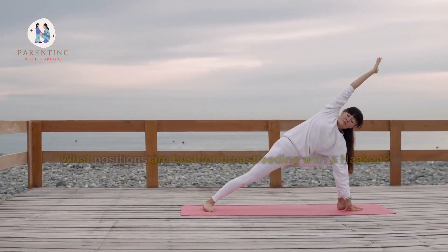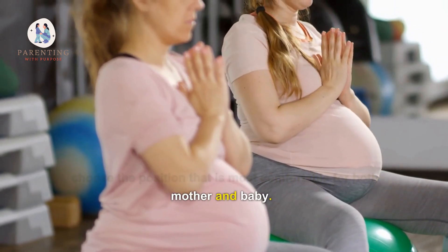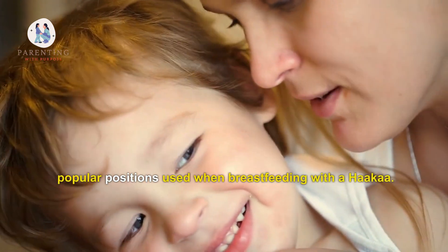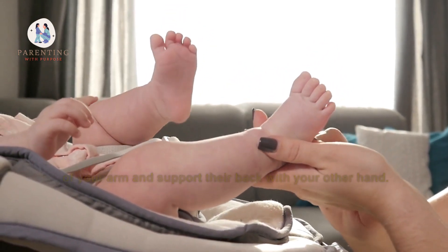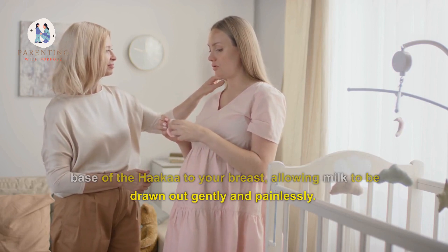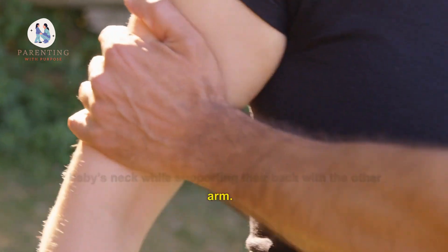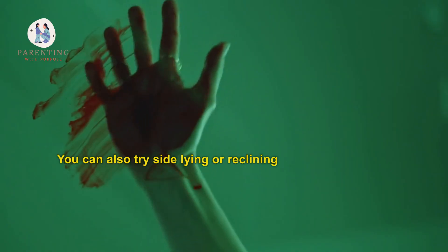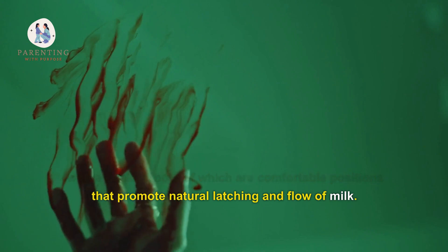When breastfeeding with a Hakaa, it is important to choose the position that is most comfortable for both mother and baby. The cradle hold or cross-cradle hold are two of the most popular positions. In the cradle hold, you place your baby's head in the crook of your arm and support their back with your other hand. You can then use your free hand to attach the suction base of the Hakaa to your breast, allowing milk to be drawn out gently and painlessly. In the cross-cradle hold, you'll tuck one arm beneath your baby's neck while supporting their back with the other arm. This position also allows you to use your free hand to attach the Hakaa. You can also try side-lying or reclining while breastfeeding with a Hakaa, both of which are comfortable positions that promote natural latching and flow of milk.